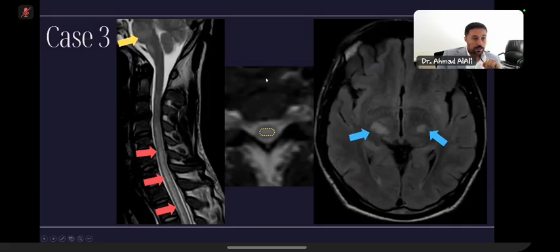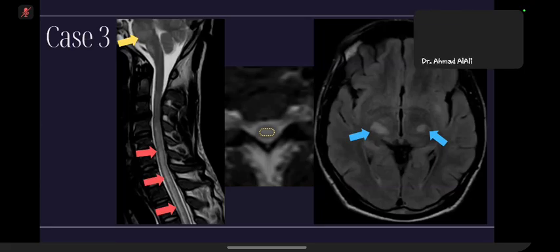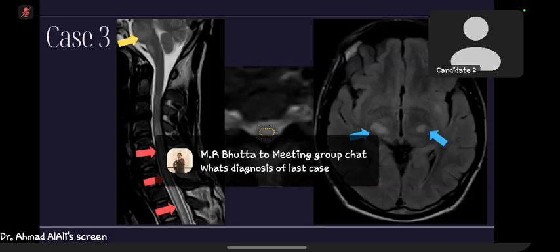Actually, I would like candidate two to join us. Candidate two, can you hear me? Yes, sir. Hi, how are you? Doing good. Fine, Alhamdulillah. Candidate two, I have this patient for you. Let me just share the images with you.